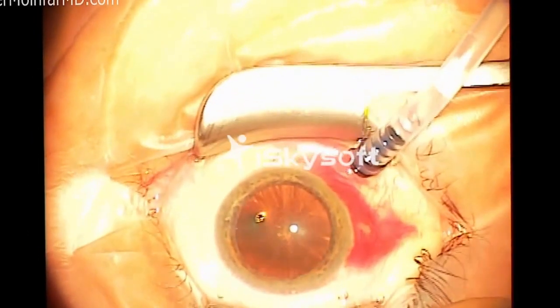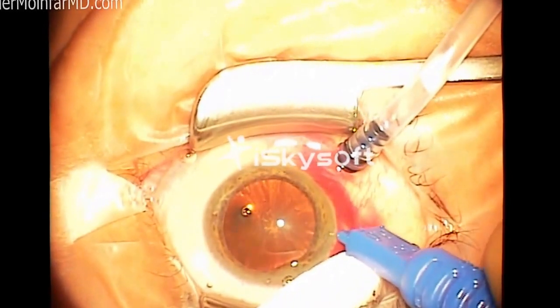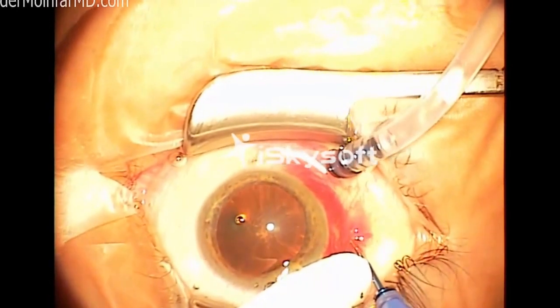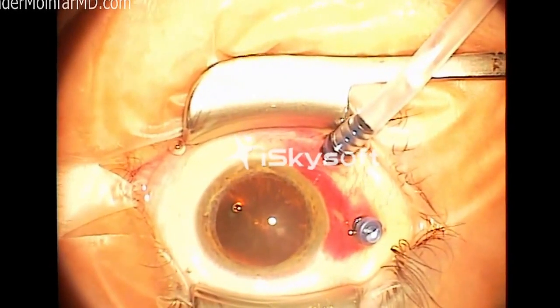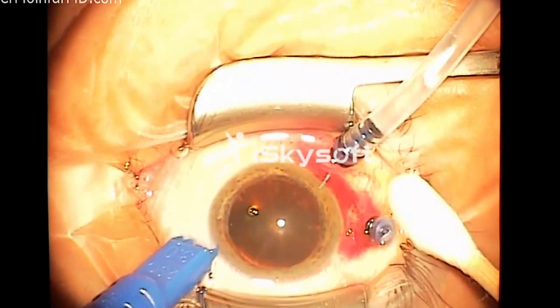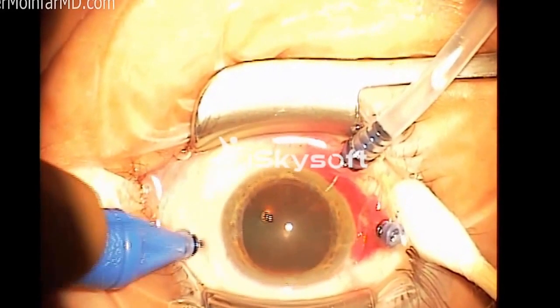Many machines, including the one that you will see being used here, can also be controlled by the surgeon on the foot pedal. What I'm doing here is placing the marking for the insertion of the second cannula. Now these are all what are called self-sealing cannulas. Vitrectomies historically used much larger instruments, and this is what's called a 25 gauge. There's also a slightly smaller platform known as 27 gauge. They're not used that often. I have personally used them, but they're not that frequent yet.